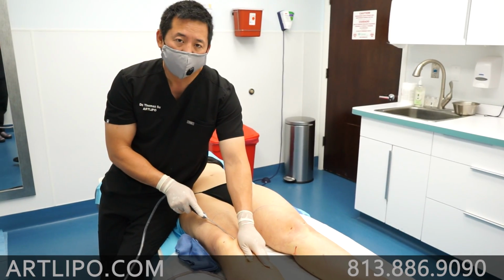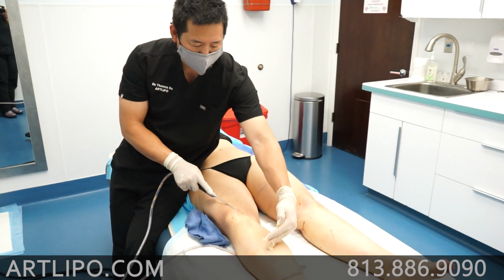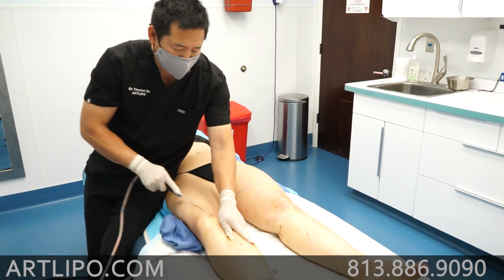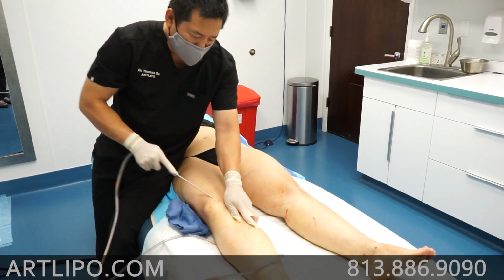Okay, hi everybody. So we're talking about the knee complex. I just want to show you this is what we're doing right here. The knee complex extends from here all the way to here, and we're almost finished with this one side, and this is how we do lipo.